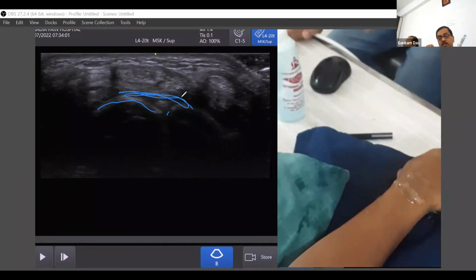that all these ligaments are not visible in every individual, every volunteer. In fact, I scanned 5 volunteers. In some, structures are nicely visible, and in some, they are not. I was looking at the visibility of these different ligaments. So I have seen that the most easily visible ligament is your short and long radiolunate ligament, both on the ventral as well as the dorsal side.